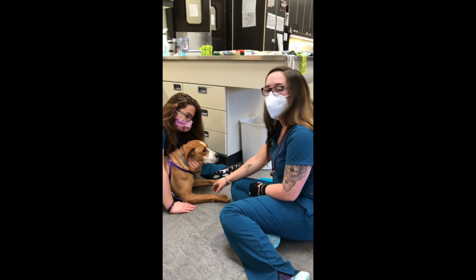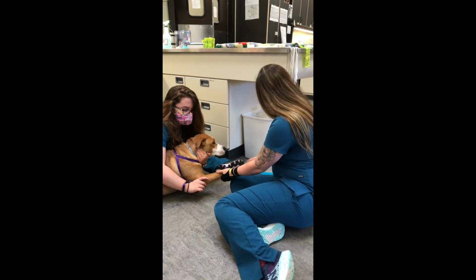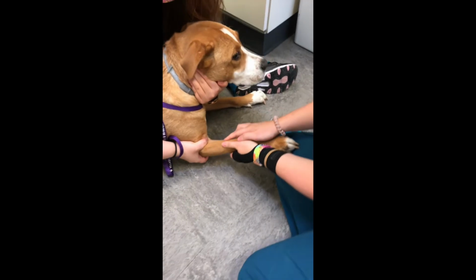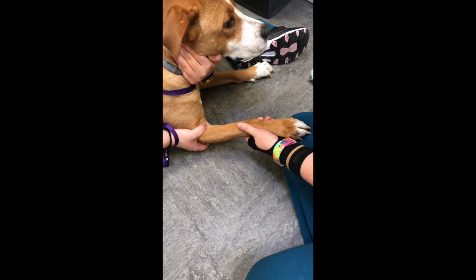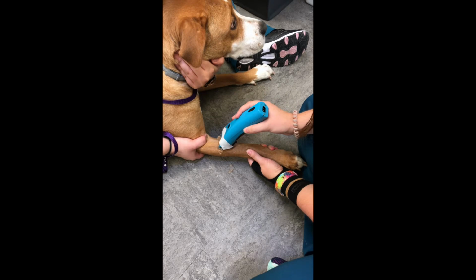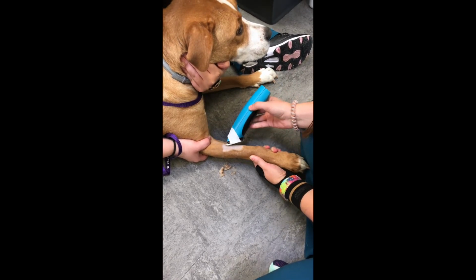Okay, so we're going to put an IV catheter in Miss Maybell before her surgery. We are going to go ahead and hold off so we can palpate the vein. With a 40 blade, you want to clip a nice area right over the cephalic vein.